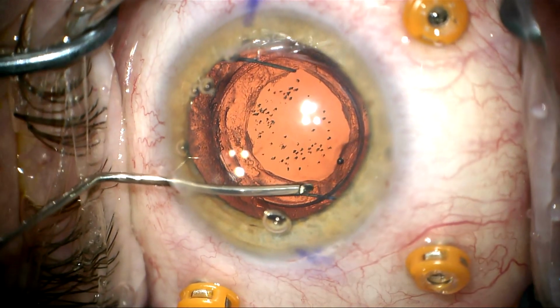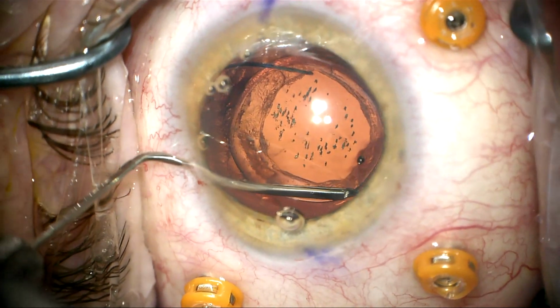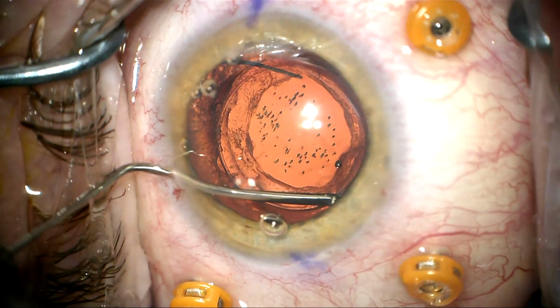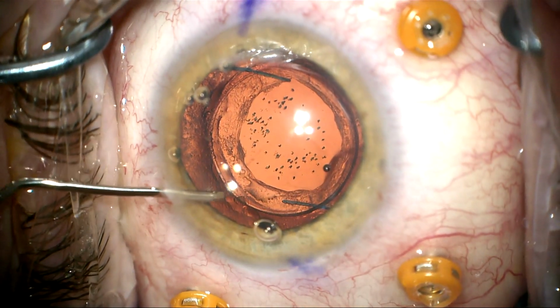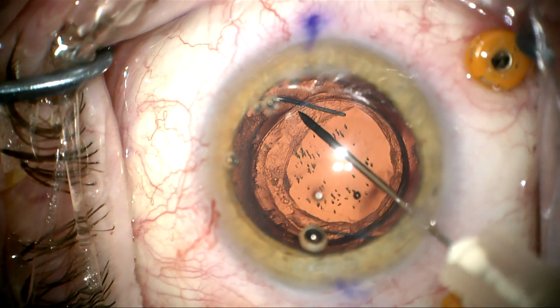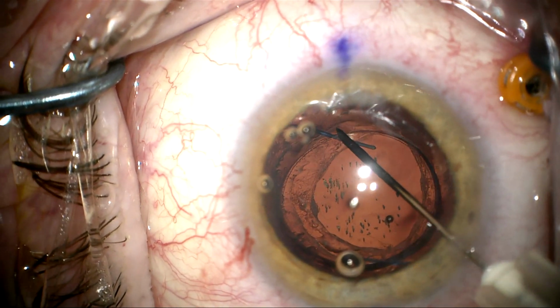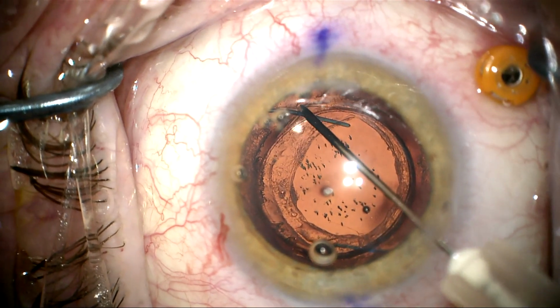But I'm having a very difficult time trying to enter the space between the anterior and posterior capsule because of the fibrosis. So here we're going to use a 30 gauge needle and try to slide under the anterior capsule rim and see if we can delineate this plane and pick this open.